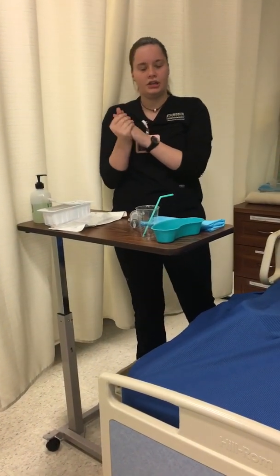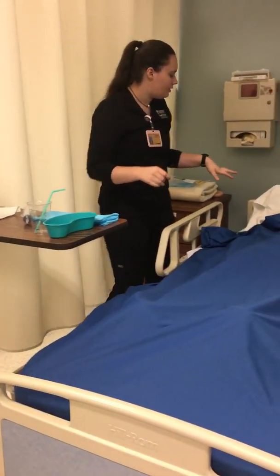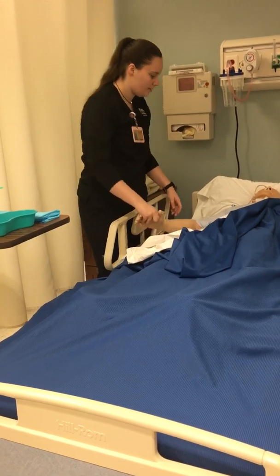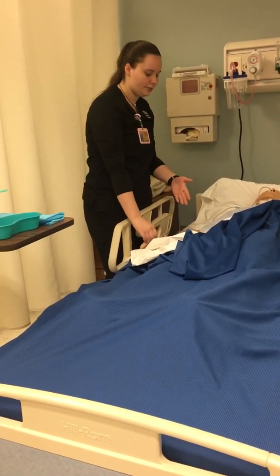We're going to perform hand hygiene. We're going to enter the room, ID the patient — what is your name and date of birth — and confirm it matches the wristband.